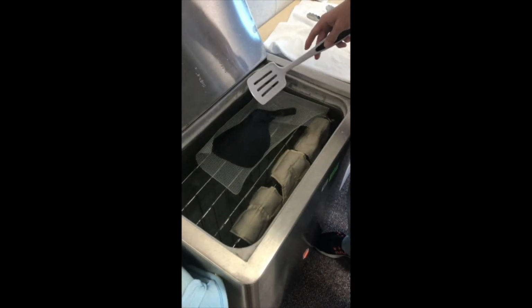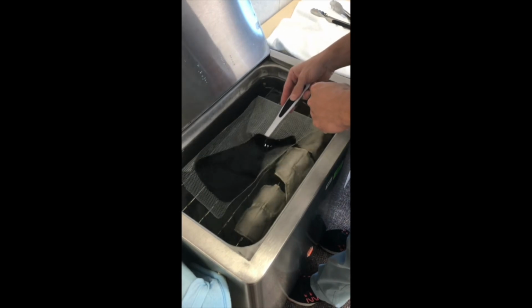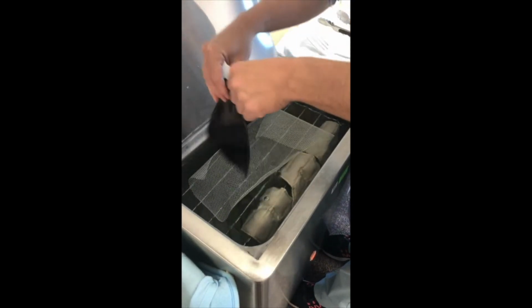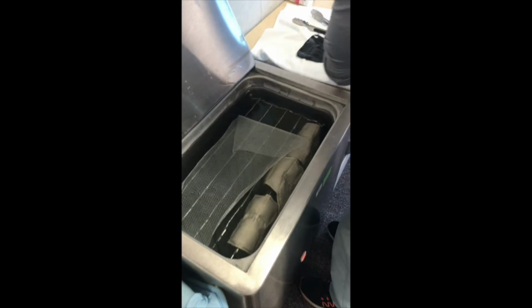After about 90 seconds, now the material is going to be nice and soft, that then we want to take it out of the hydrocollator. We do not want to take it out this way because gravity is going to stretch out the material. We want to try to take it out this way to minimize the stretch and dry it off on a towel before we bring it to our client.